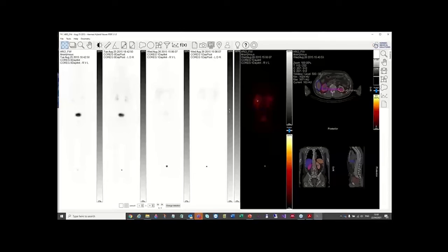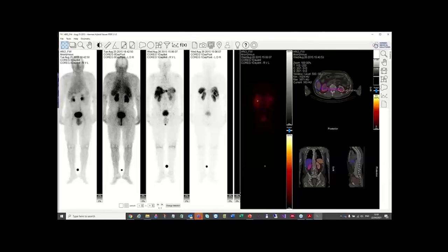Only the mean dose is given, so you can't do that radiotherapy style dose volume histogram or D95% measurements, and also you don't use your patient's anatomy directly in it. You have to choose one of the models that's inside the software. So there are many drawbacks, but one of the positives is that you don't have to have quantitative imaging or quantitative SPECT at every time point. You can do it with planars as well.